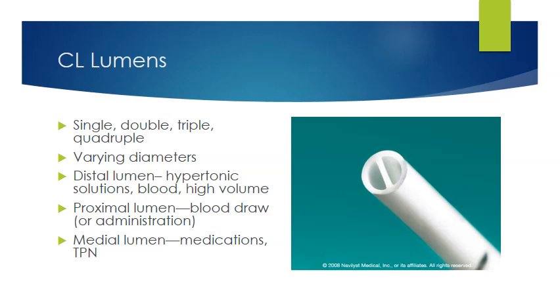Now, that being said, this is what they say these lumens should be used for. I'm going to tell you in a hospital setting when you go in there that each lumen could be used for different things, because say you have a double lumen but 1 lumen is clotted off, you're going to go ahead and use the other lumen for that purpose.